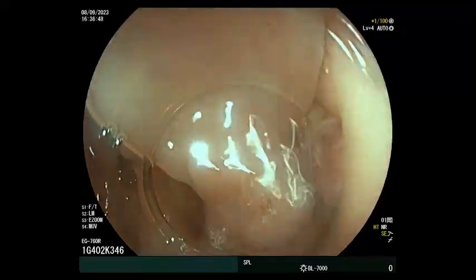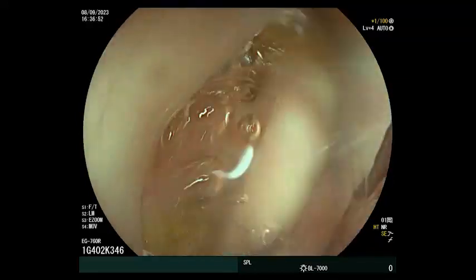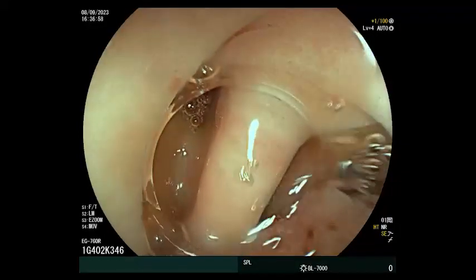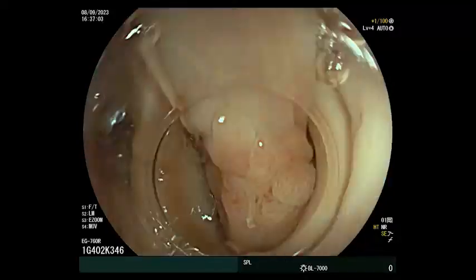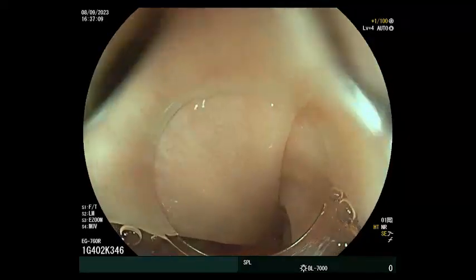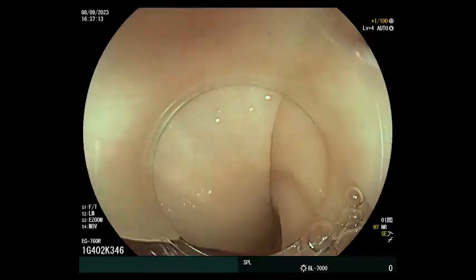We have a lot of methods in managing pedunculated polyps. We can start with EMR. Actually, for EMR, you can put some clips first and then cut by snare, or you can use an endoloop and then cut by snare. Or sometimes you can inject adrenaline in the pedicle, and then you have to be very careful of the bleeding, and then you close the bed with clips.